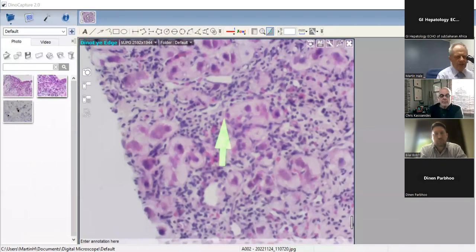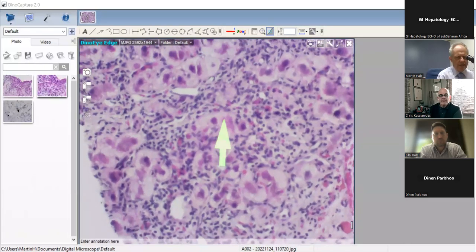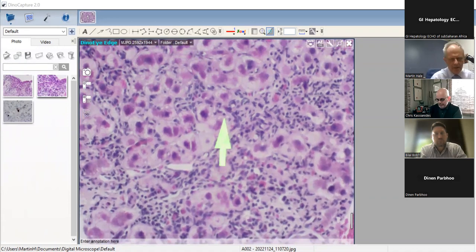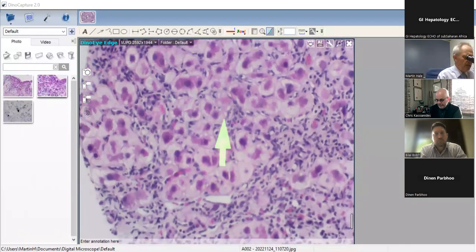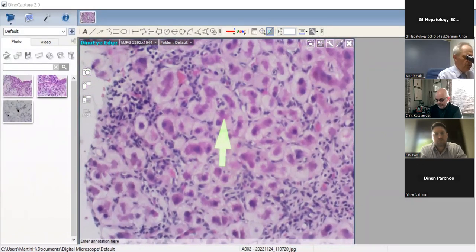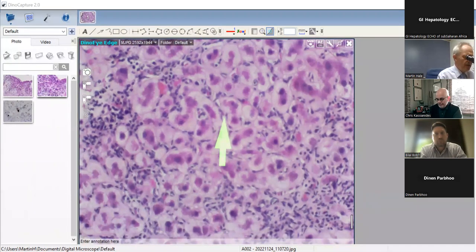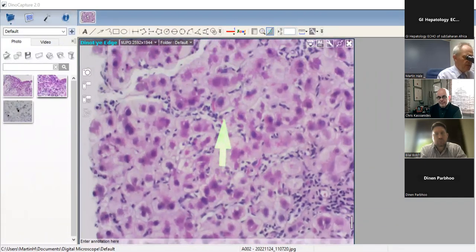All those things go to mind. And look at this infiltrate. You can see how it is actually separating or tracking between the hepatocyte trabeculae. And you can see the twinning of these hepatocellular plates. You can see the duplication. Look at that there. You can see that in that cord there, we've got four hepatocyte nuclei. So twinning of hepatocyte plates is certainly there.